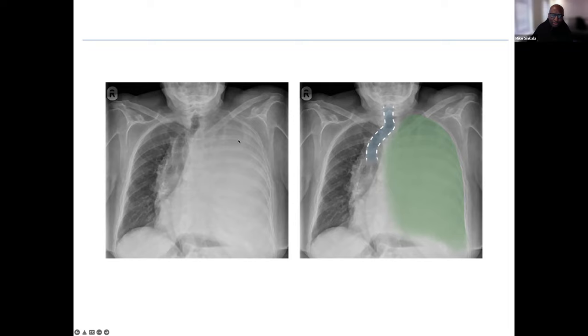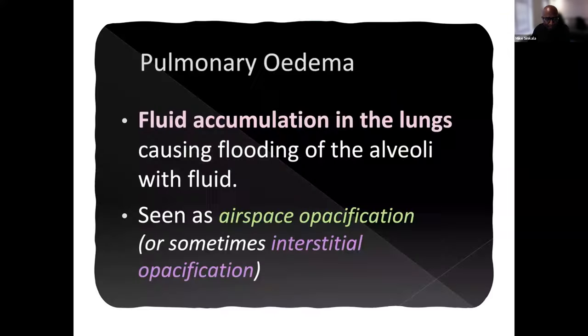Notice also that in pleural effusions, the intercostal spaces get a little bit wider, and the ribs tend to spread out. If you had a lung collapse, it will pull the intercostal spaces together, and you may see that the separation between the ribs becomes a little bit narrower, unlike in pleural effusions in this case.